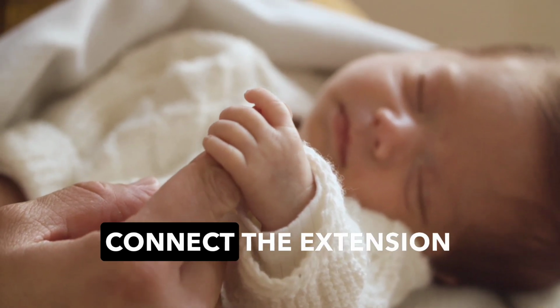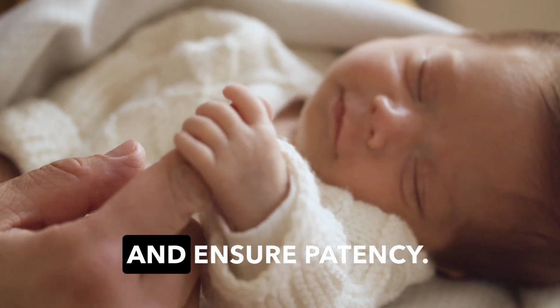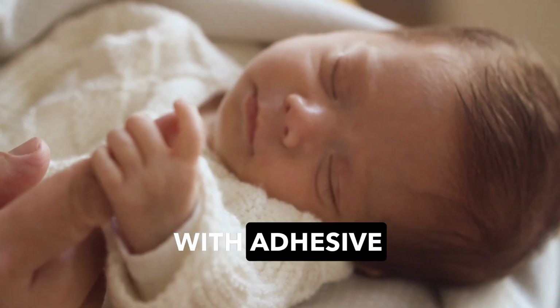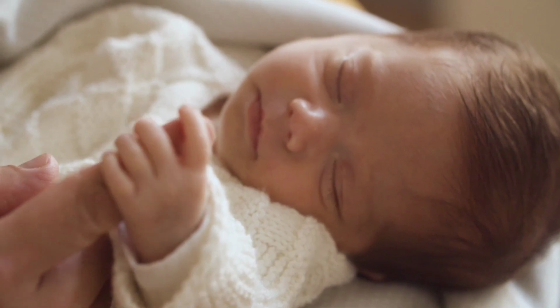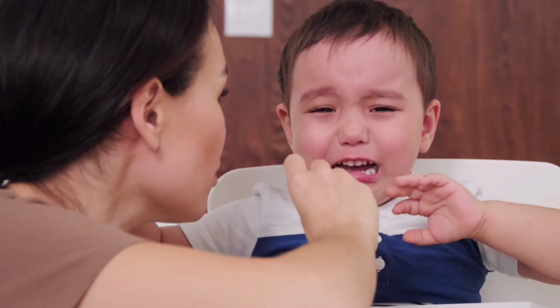7. Connect the extension set or fluid line, flush with normal saline, and ensure patency. 8. Secure the cannula with adhesive tape or a transparent dressing. 9. Remove the tourniquet and check for proper flow.